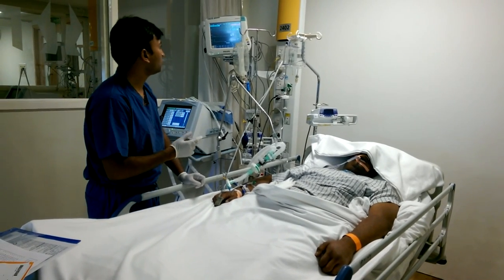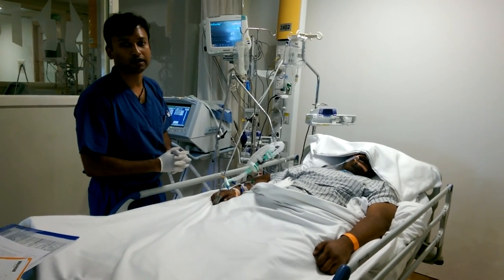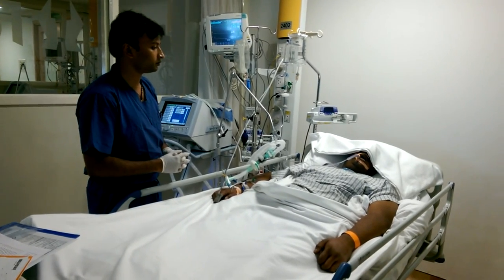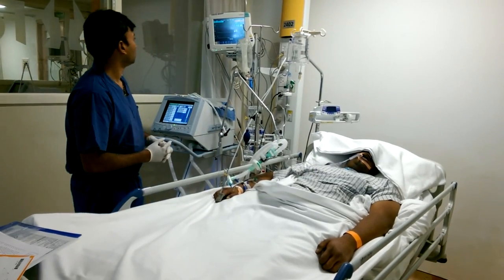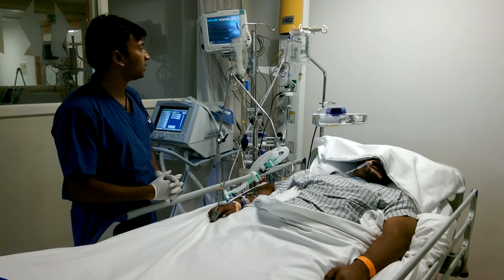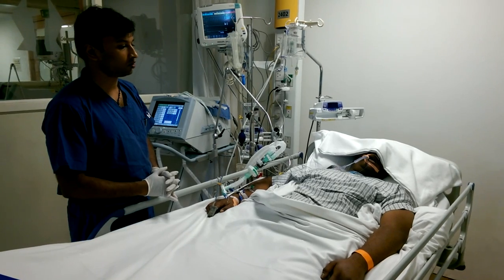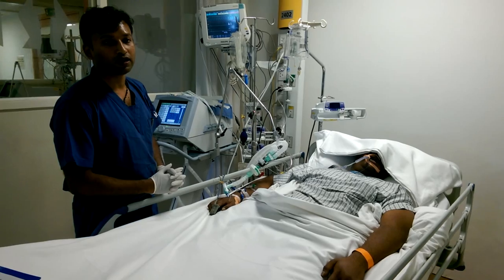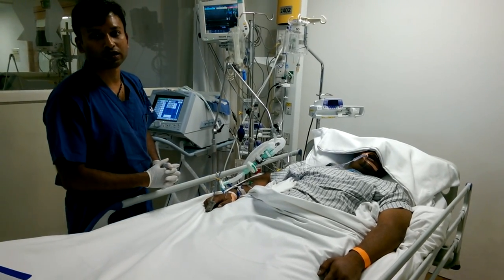As you can see, there is no desaturation or hypotension, so we'll try to extend the apnea test till 10 minutes. As you can also see, there are no respiratory efforts. Now the 10 minutes are over, and fortunately there has been no BP fall and no desaturations. So we can extend by 5 minutes further, or else we can take the sample and see if there is a rise in the CO2 levels.